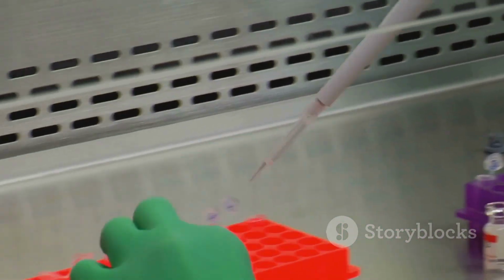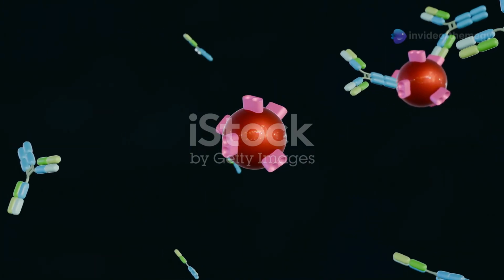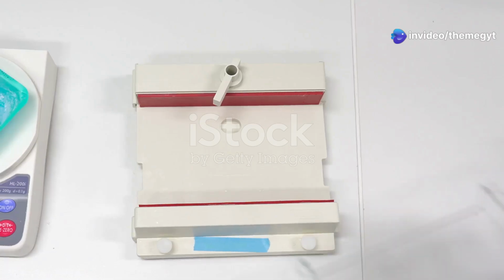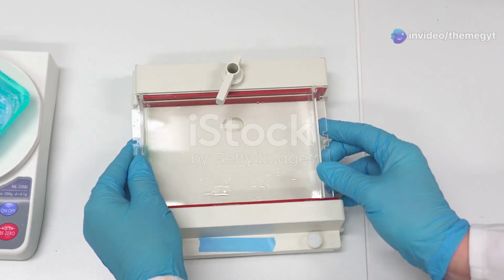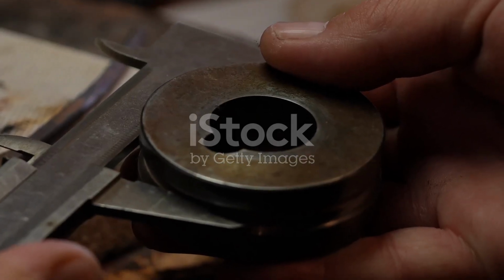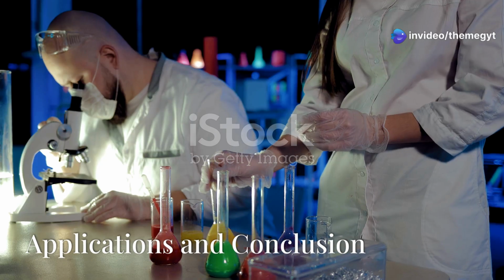To begin, a small well in the gel is filled with the sample. Next, the antigen from the sample and the antibody in the gel bind together, forming a complex. This complex creates a visible ring or a precipitate ring around the well. The size of the ring tells us how much antigen is in the sample. A larger ring means more antigen.